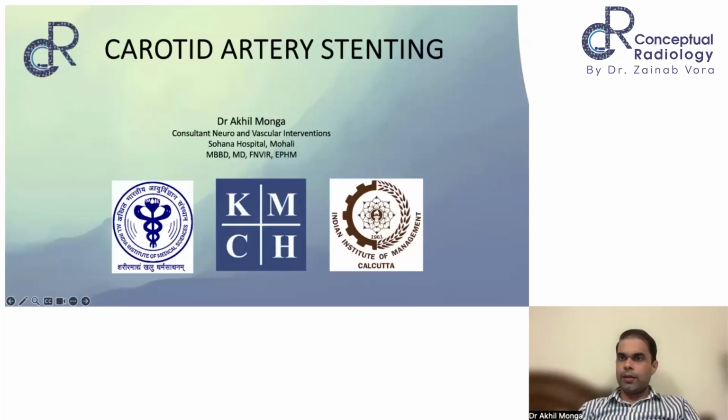Today, this is our third session in the interventional neuro techniques. We had a couple of classes on anatomy, then two classes on acute stroke and its management. Now, this is another class which is associated with stroke, but this is something when done standalone is more of a prophylactic or secondary prevention, like somebody had initial symptoms or has already developed a risk factor and we are trying to prevent stroke.